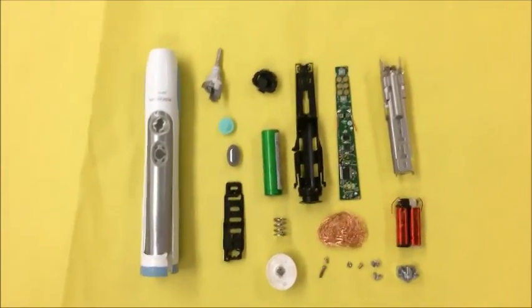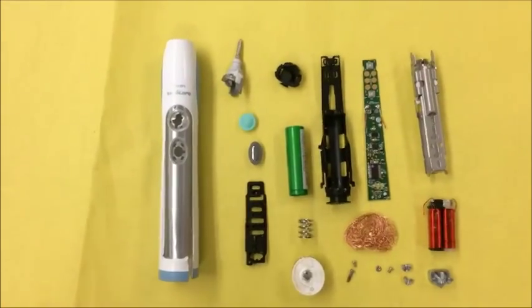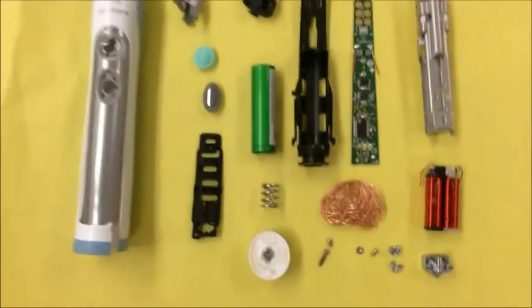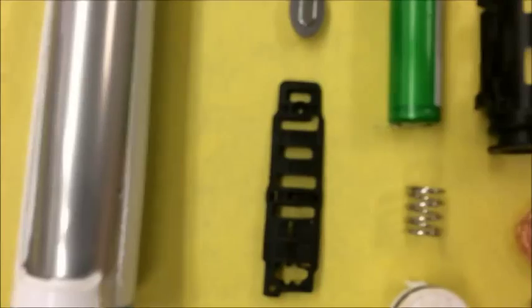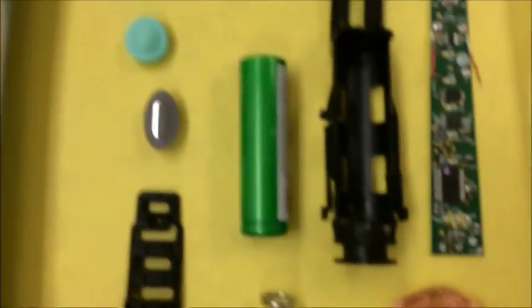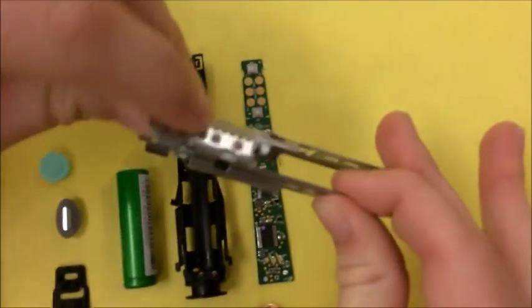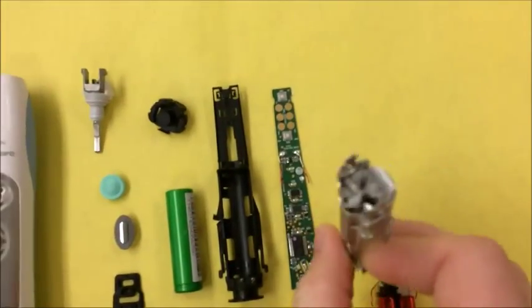This is the Philips Sonicare toothbrush. It works by just reciprocating the toothbrush part. There are 21 parts total, but some of them we weren't able to completely take apart. Like this has some rubber on it that we couldn't get off. This over here has rivets that we weren't able to take out, so there's pieces inside of here as well.